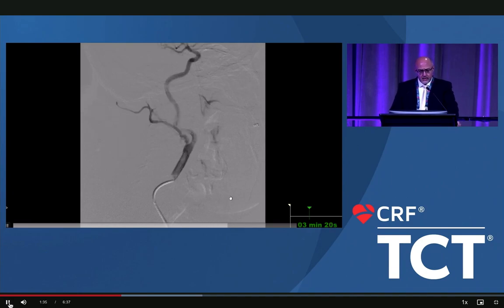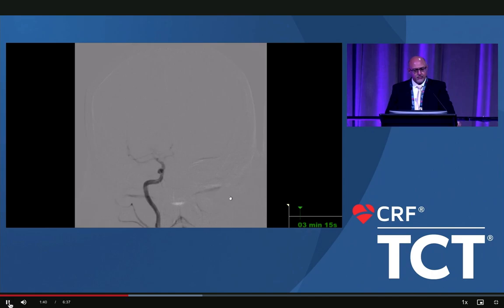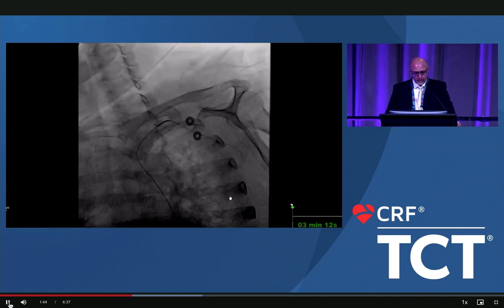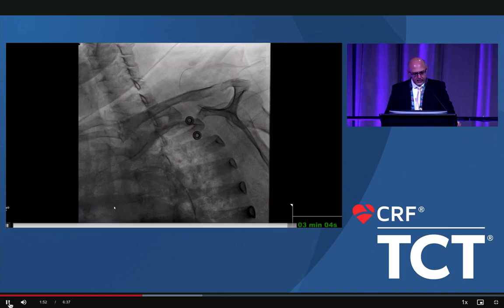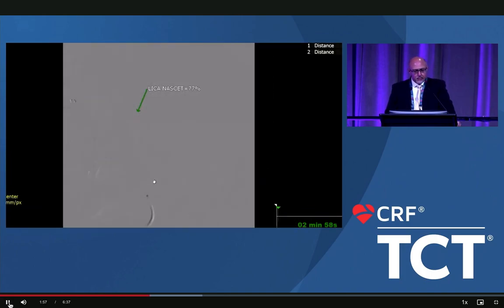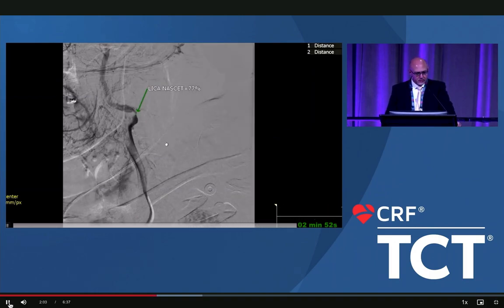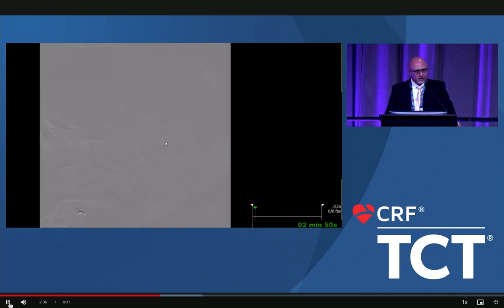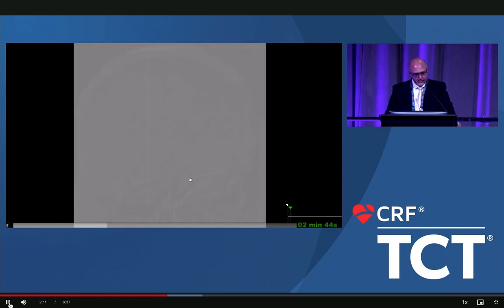I always shoot the opposite side. The right internal carotid artery just had mild luminal irregularities. The right-sided cerebral angiogram was fairly unremarkable. To engage the left common carotid artery, I did have to utilize a Simmons 2 catheter, which I always prefer to form in the left subclavian artery rather than doing helicopter spins in the aortic arch where I might dislodge some plaque and cause a stroke. We selected the left common with that Simmons 2, and it confirmed the severe stenosis of the left internal carotid artery. Cerebral angiograms on the left side were fairly unremarkable. She was noted to have a persistent left posterior cerebral artery, which you'll see here.